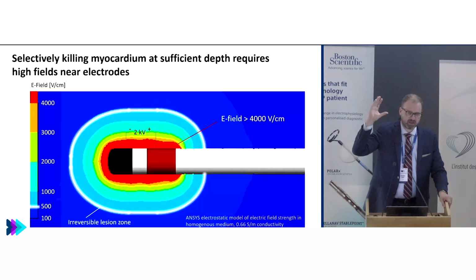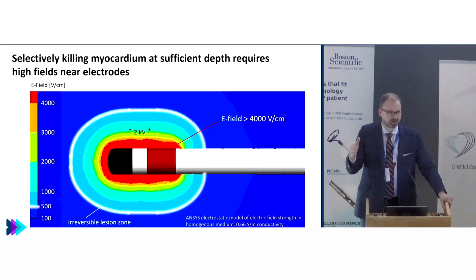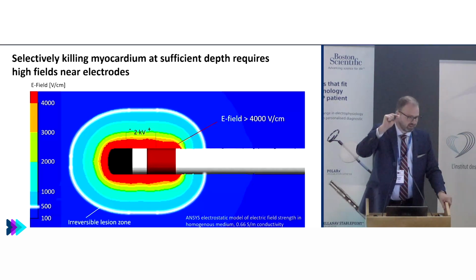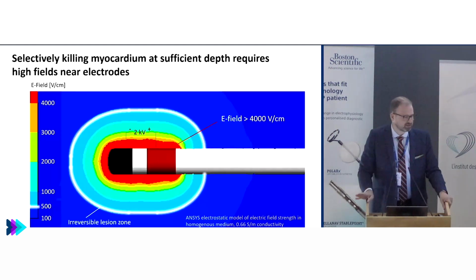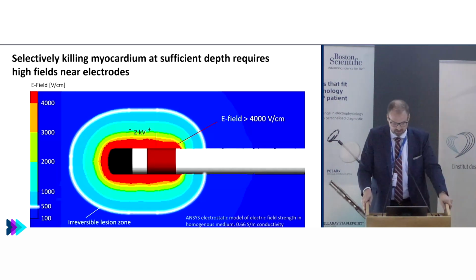So if you're treating a right superior vein, and we know patient anatomy differs and the course of their phrenic nerve is different for everybody, but some people have it right there. It's just right behind the wall. And you're pushing really hard because it's hard to get to the right superior, and you're maybe putting more applications there and things like that. It's definitely not surprising that you would have 0.4, 0.5% transient phrenic nerve paresis just because of this. It's just being exposed to a higher field, if that makes sense.